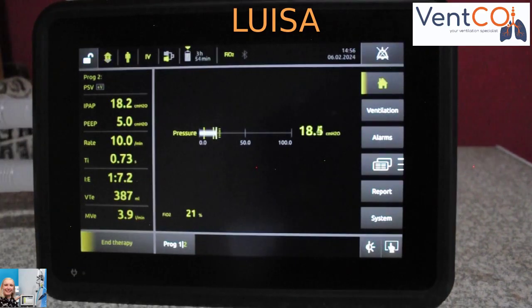That is the Luisa ventilator from Löwenstein Medical in a nutshell. I hope this video assisted you in understanding the specifications and the benefits of this machine a little bit better.